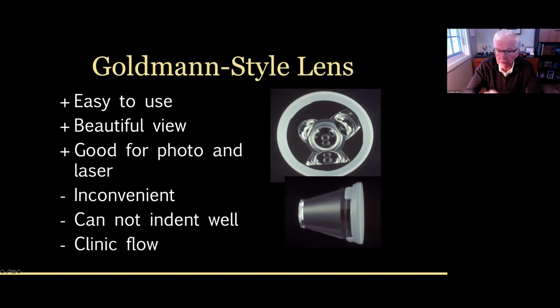If you have a true three-mirror Goldmann lens, it's the shortest of the mirrors that is designed for looking at the angle. The other mirrors are more designed for peripheral retina.